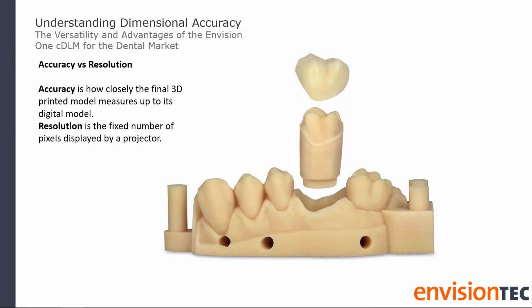So what is accuracy and what is resolution? Accuracy is how closely a final 3D printed model measures up to its digital model. Usually, dimensional accuracy is measured within a certain XY tolerance, or it's reported as a total percentage of a scan accuracy against the model. The only way to determine accuracy is to print the model, scan this model, and then compare it to the original digital model. On the other hand, resolution for DLP and cDLM technology is the fixed number of pixels displayed by a projector.